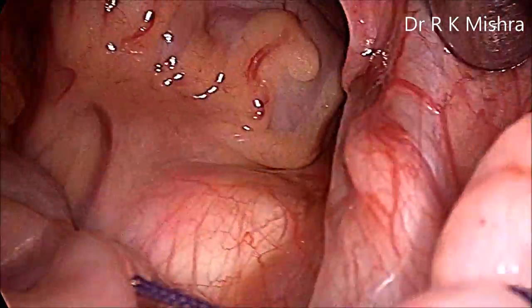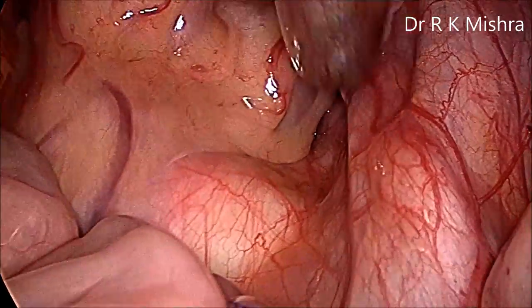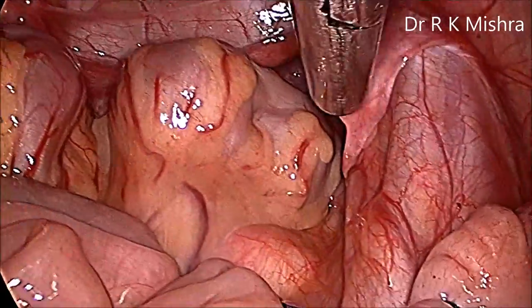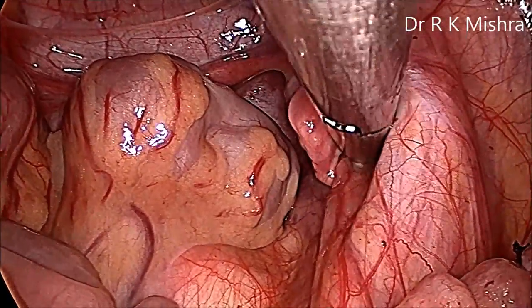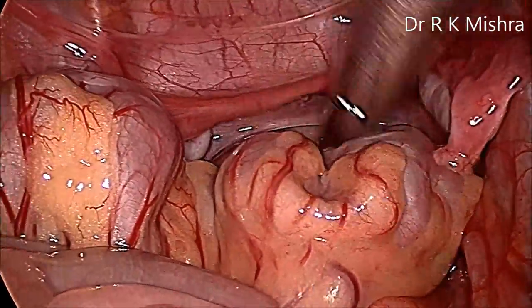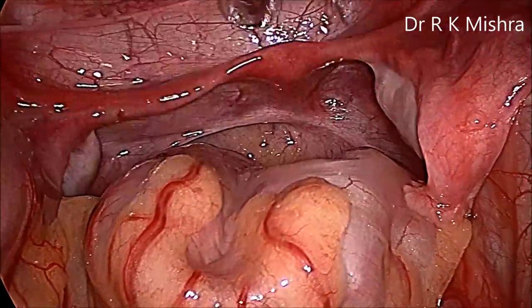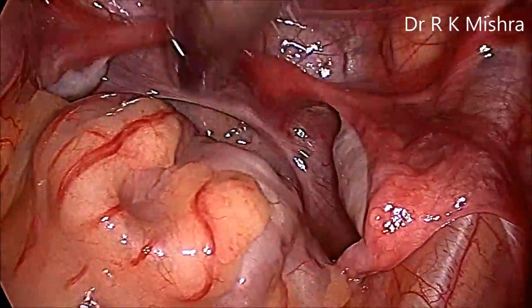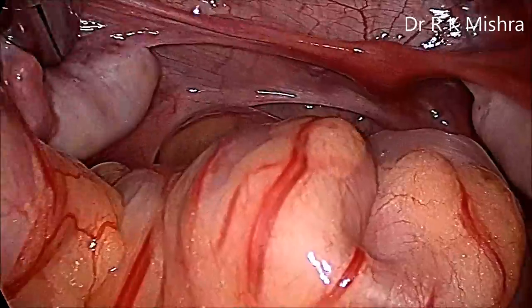Now this is the diagnostic laparoscopy. We can see the ureter crossing the common iliac vessel, the sacral promontory in the middle, the fimbria and fimbrial end of the tube, the external iliac artery, external iliac vein, and below is the ovary. This is a very small uterus because it is only a six-year-old child — it is not yet well formed. On the other side: the tube, the ovary below, the utero-sacral ligament, sigmoid colon, bladder above, and the uterus.